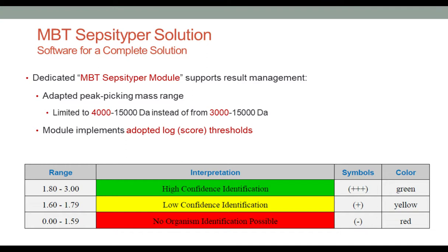We have validated the mycobacterial organisms when we're doing routine cultures, and we are using that to do mycobacterial identifications. We haven't really used it for our blood cultures, and of course, you don't get very many positive mycobacteria on your blood cultures. But when we've used it for our routine cultures, we do see that it works, and we get correct identifications from it.